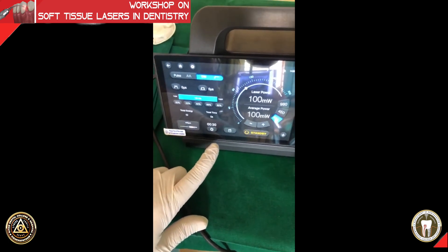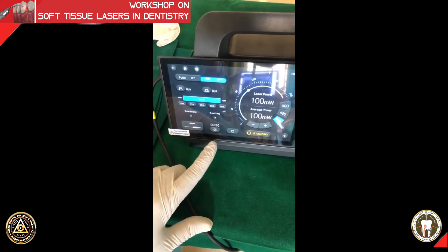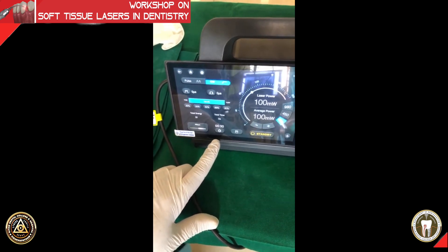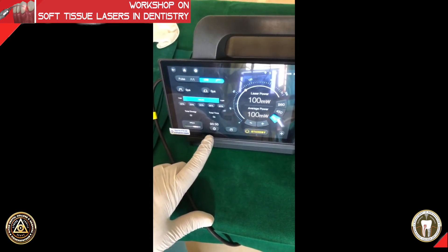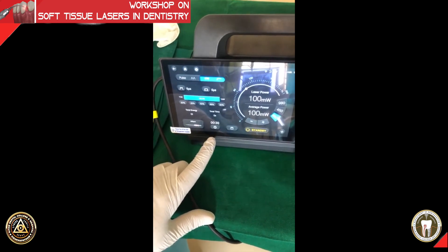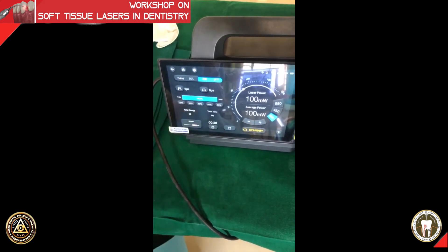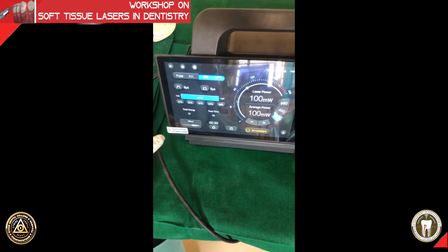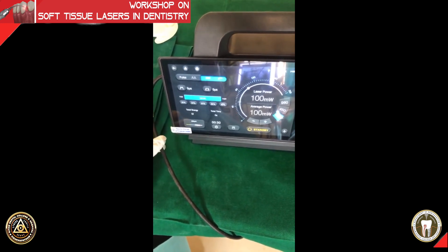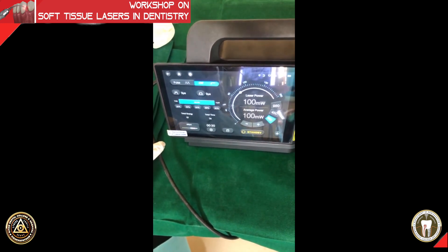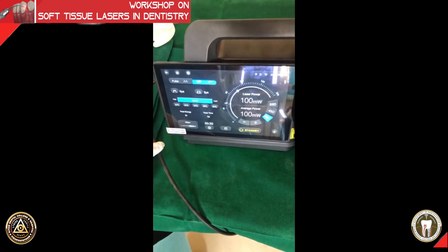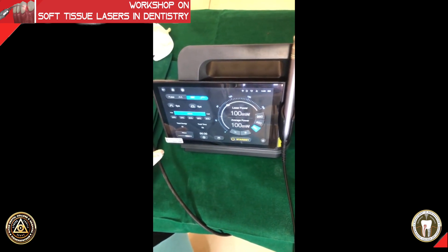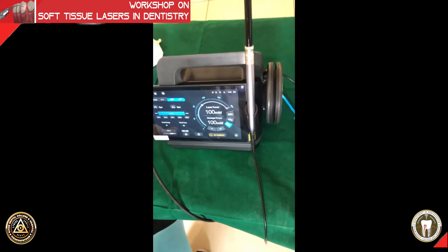There is also a timer on this machine which makes life easy, because otherwise you would have to keep track of time yourself. The duration of irradiation per pocket is normally 30 seconds buccal and 30 seconds lingual, or you can do 15 seconds each for buccal, mesial, lingual, and distal — 15 seconds per site, four sites, with a maximum of 60 seconds total. I have preset it to 30 seconds so the machine goes to standby automatically.